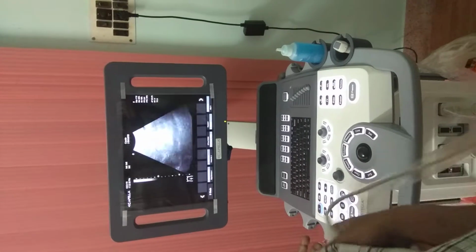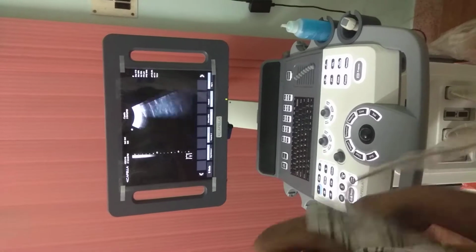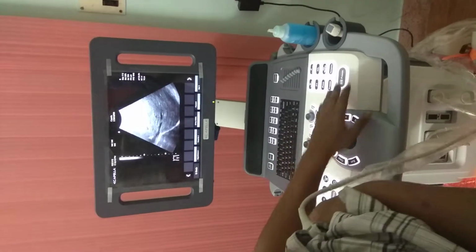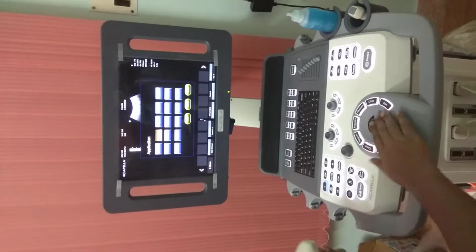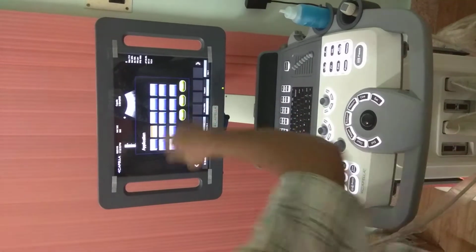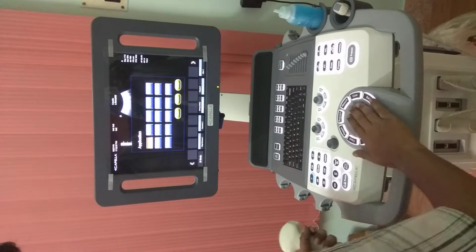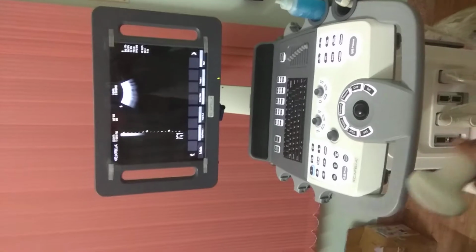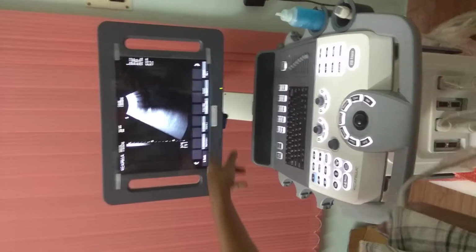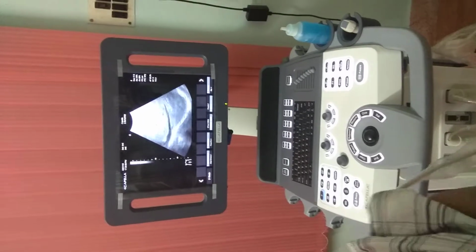So what we are going to do, we are just going to change this thing. As you can see, this is now on one parameter. Now if we just preset it, it is on OBS selected now. If we just go to a different parameter, we can adjust here, and likewise we are just selecting abdomen for test purpose. We selected it and we press select. The machine will call upon the different imaging parameters, as you can see, or the differences on image at this moment, like this.